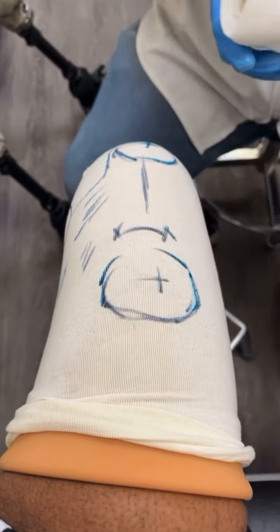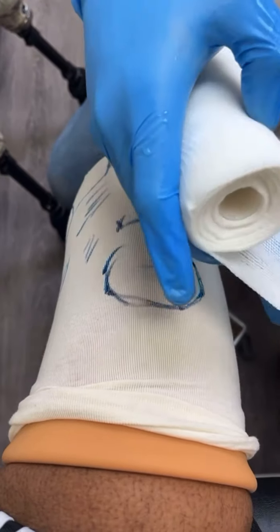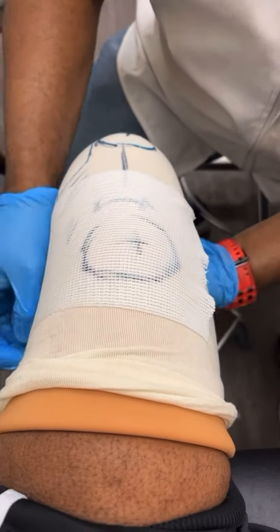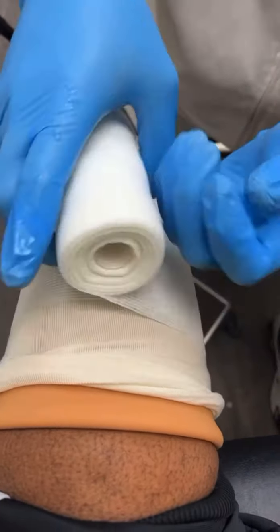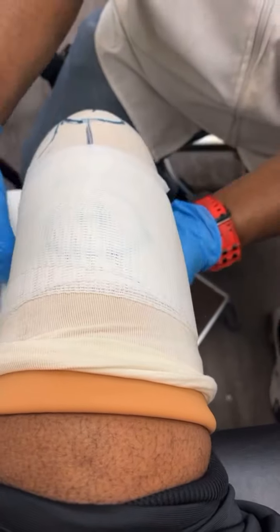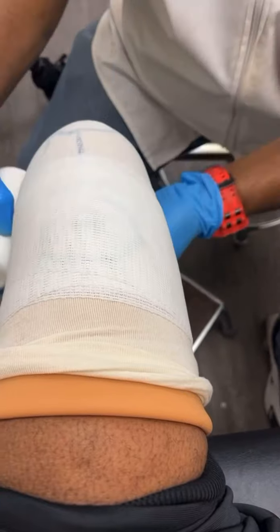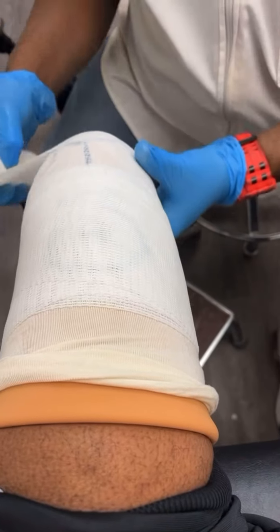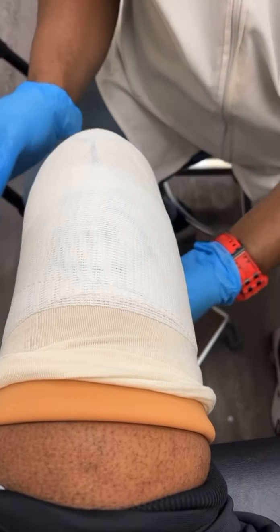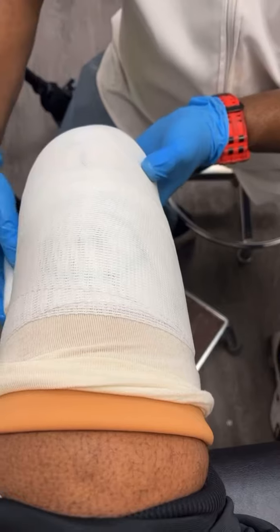Now he's about to wrap it with the cast and mark all the bones — all the different bones I have — which is a reference for him once he begins to mold and make the molding, which becomes the socket. He knows where the marks are. I wouldn't know what the hell to do — that's why he's the practitioner.